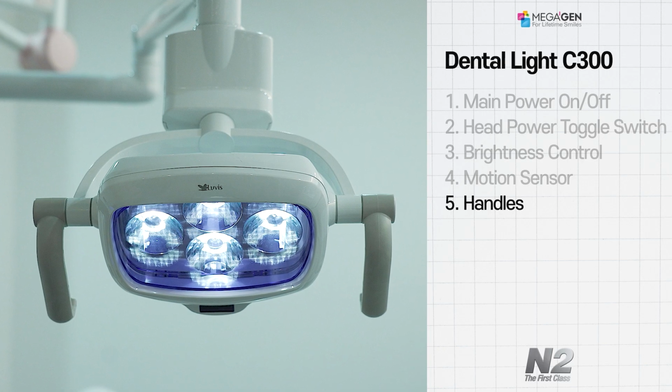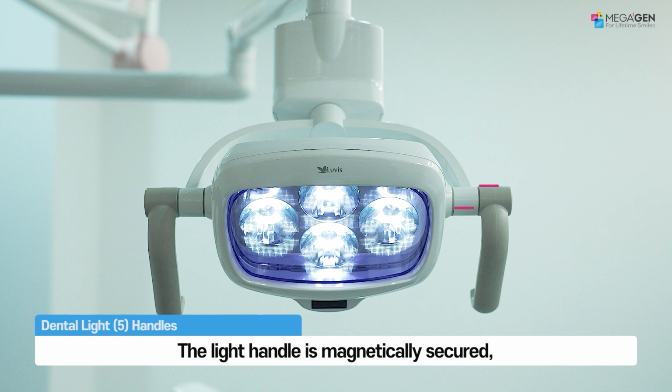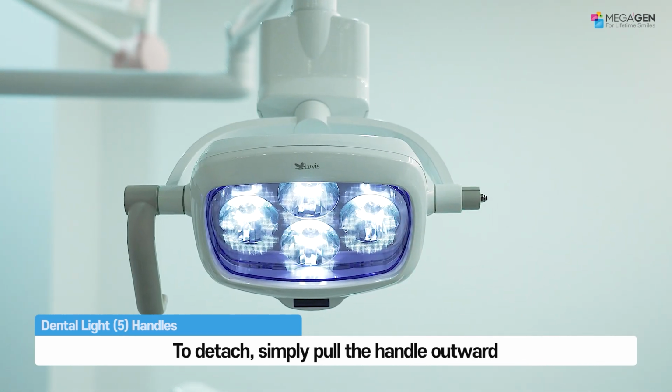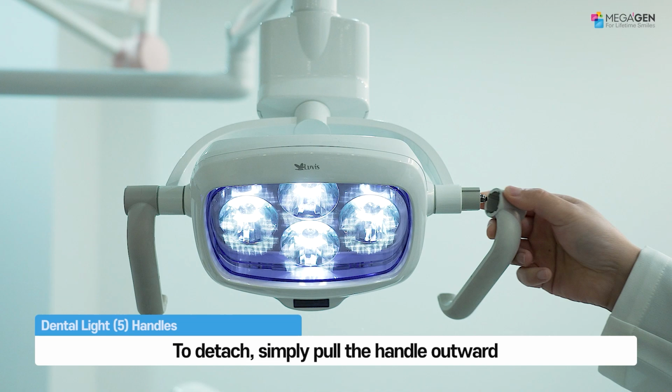How to attach and detach the light handle. The light handle is magnetically secured, allowing easy removal for sterilization. To detach, simply pull the handle outward.